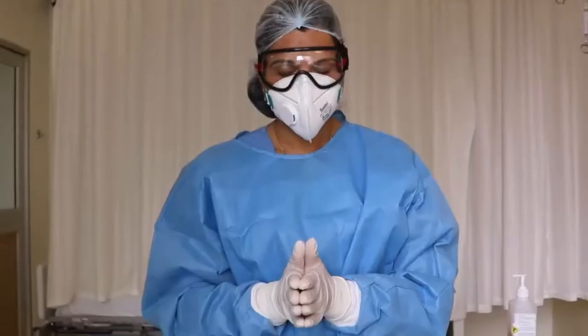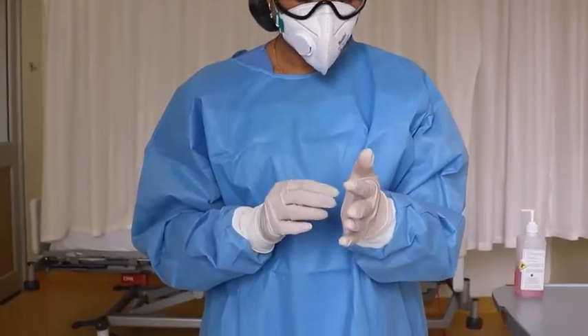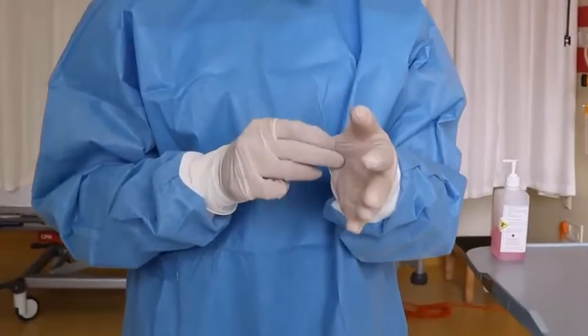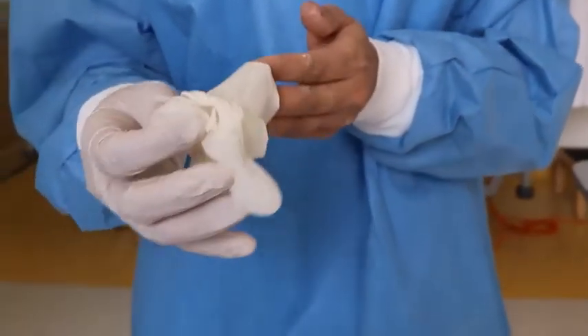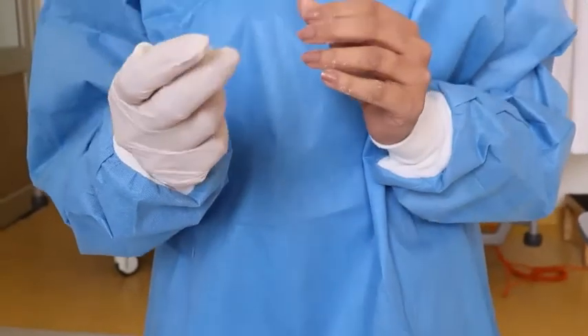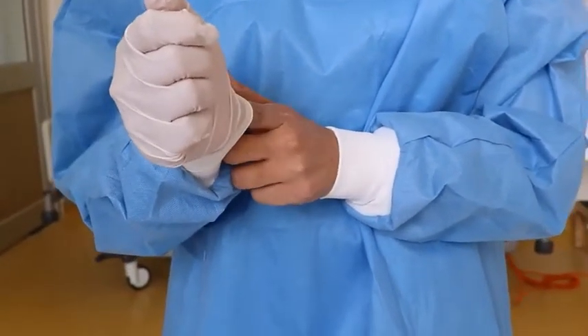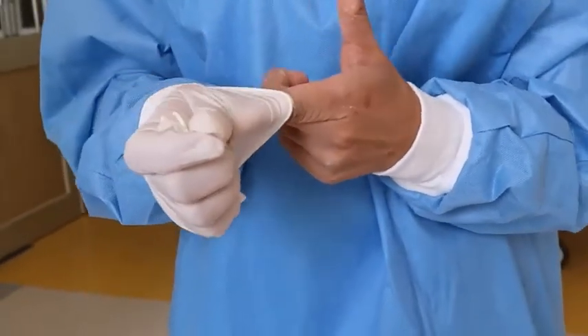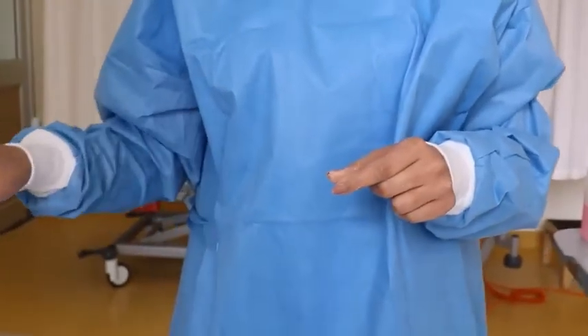I will demonstrate how to remove gloves. Use one hand to pinch the glove and peel it off. Grab the removed glove in the other hand, slide your finger underneath that glove, peel it off, and then discard both gloves.